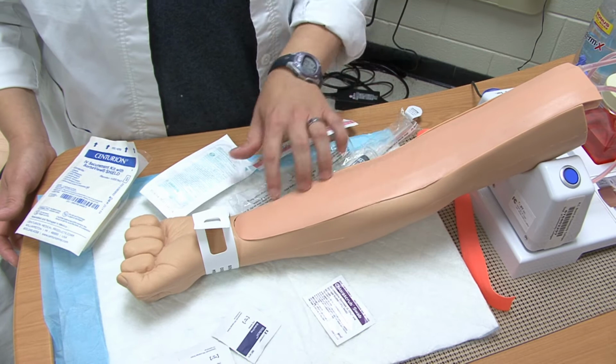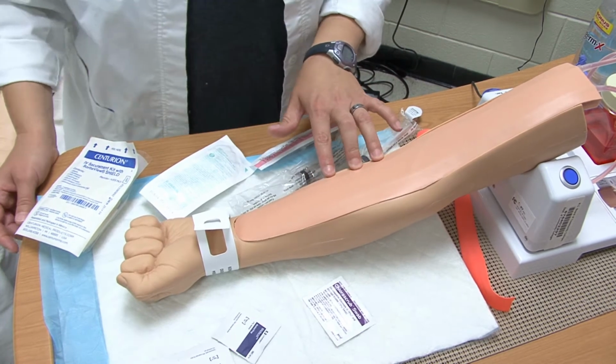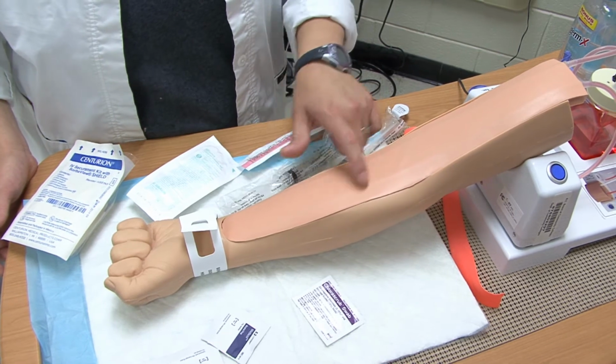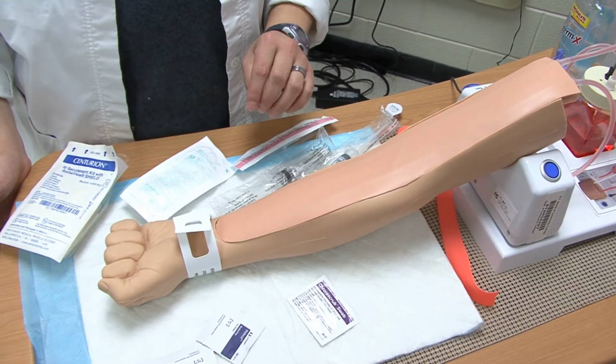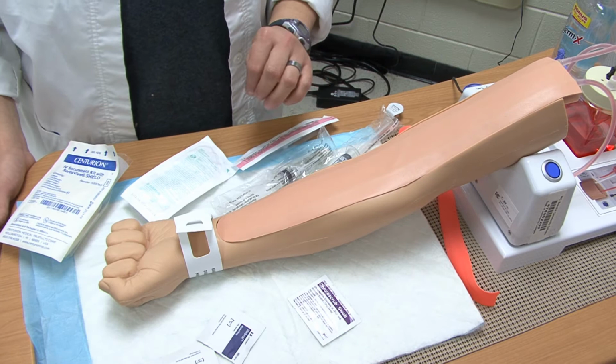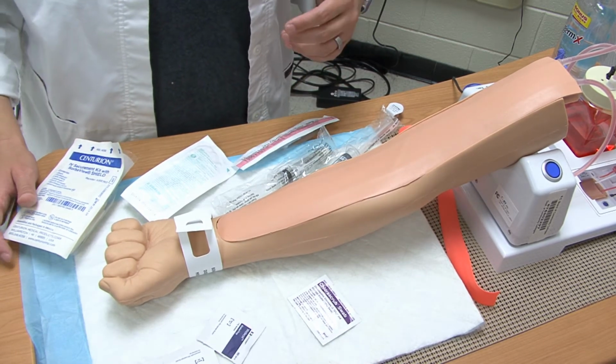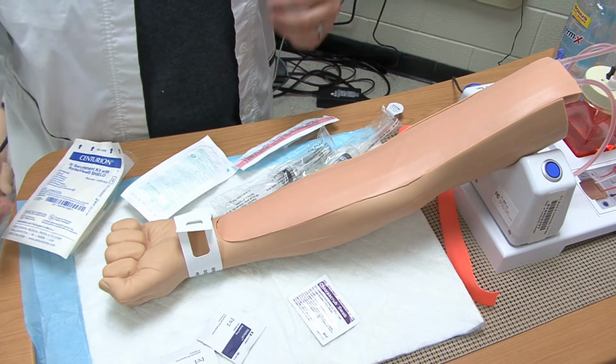If your patient has a lot of hair in the area that you found, then depending on agency policy, you might clip the hair in a 2-inch area around the IV site so that it doesn't interfere with the insertion, but also with the securement device when you put it on the patient. So now we found the site on him, we're going to go ahead and prepare equipment.